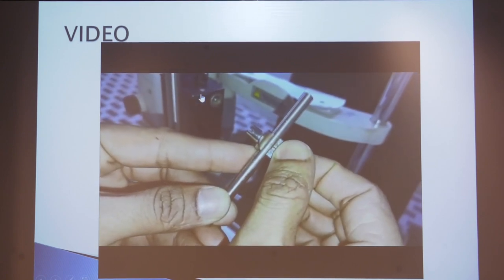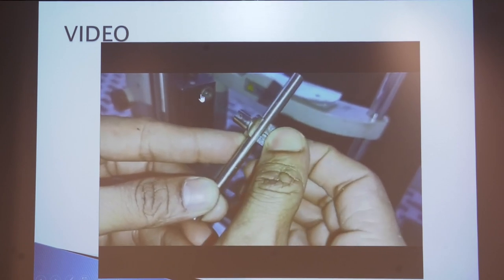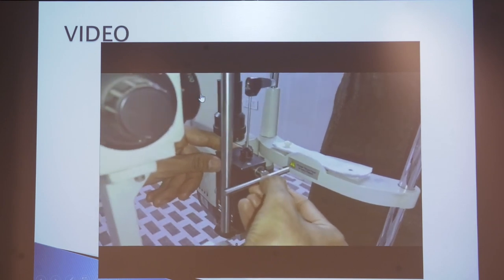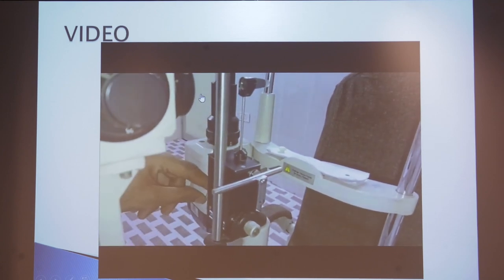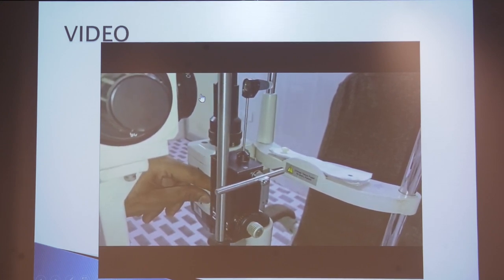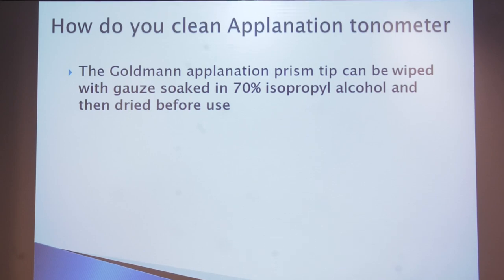Put it in the holder and observe the movement of the biprism again. In the Indian standard scenario, I usually accept plus 18 or plus 22 — meaning plus or minus 2 in the 2-position is normal. You can repeat the same process at the 6 or 60 mmHg position.